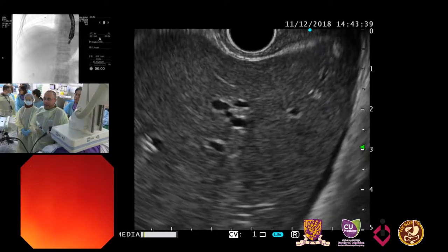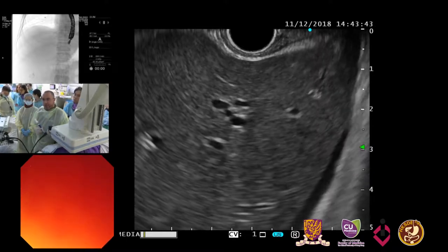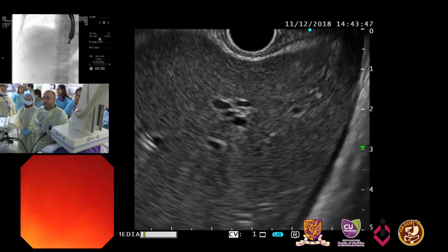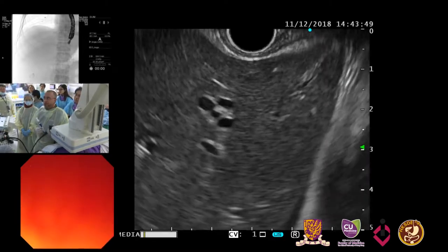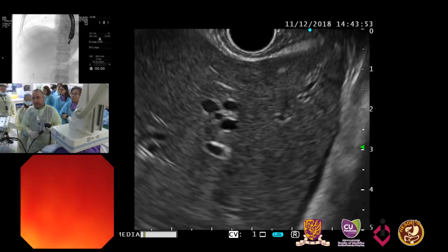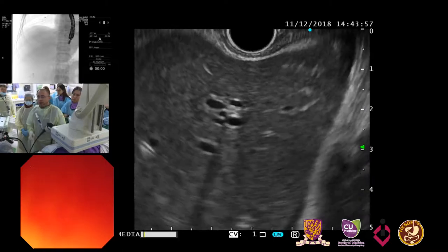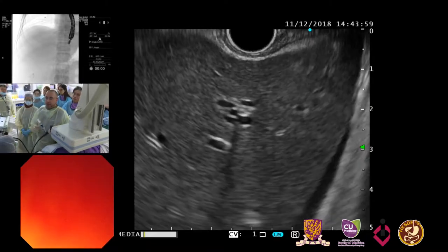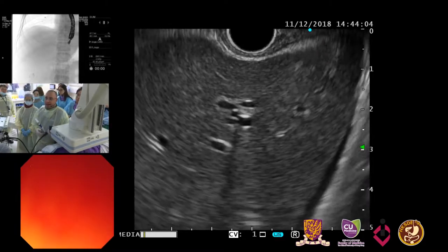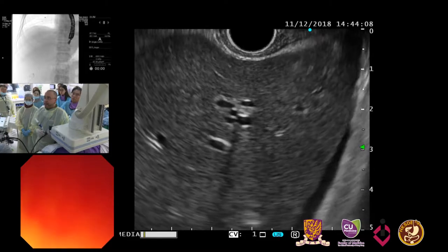So we're gonna go ahead. When you're scanning through the abdomen, I can see a lot of ascites. Does it border your choice? Yeah, so this patient has some ascites. There is no ascites in the way. So when the ascites is mild, I think this procedure is acceptable. When it is a large, uncontrollable ascites, then it is not. Definitely, we're going to give antibiotics.